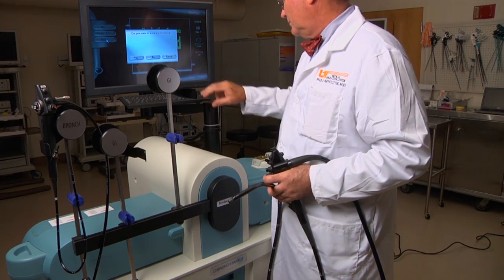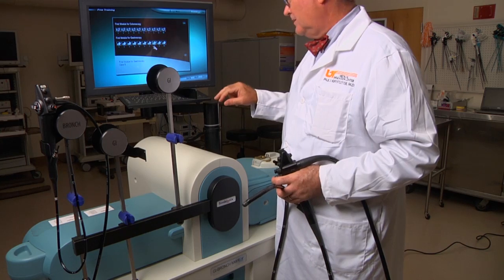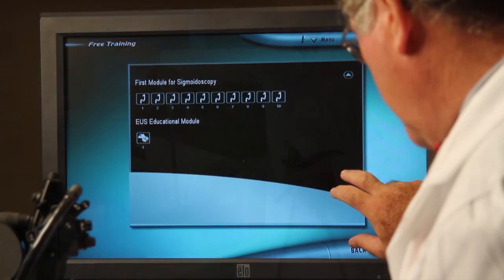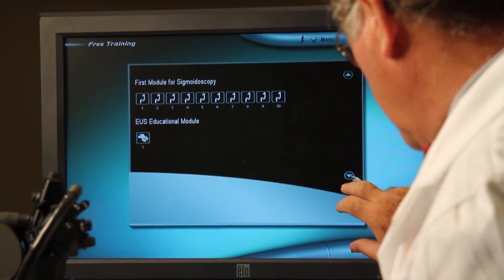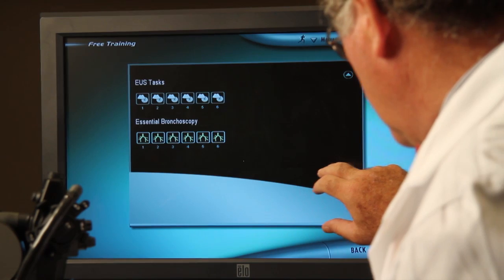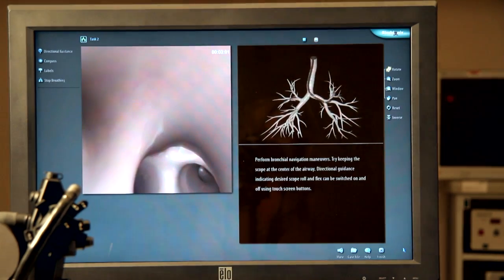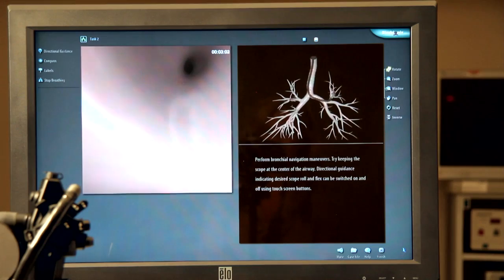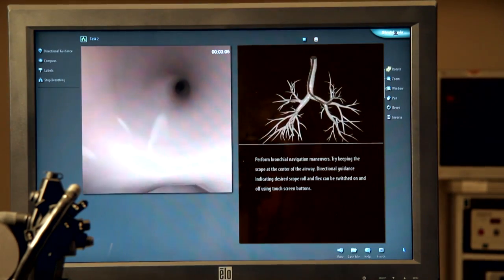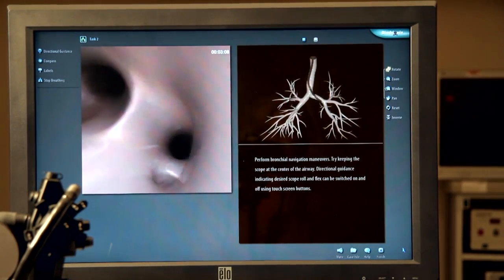This innovative simulator houses more than 120 tasks in virtual patient cases. The simulator provides a virtual reality experience, and curricula is set by the instructor. Patient scenarios range from simple diagnostic procedures to advanced endoscopic procedures.